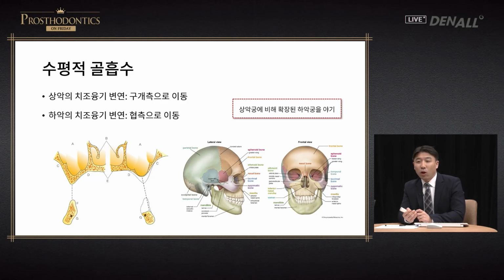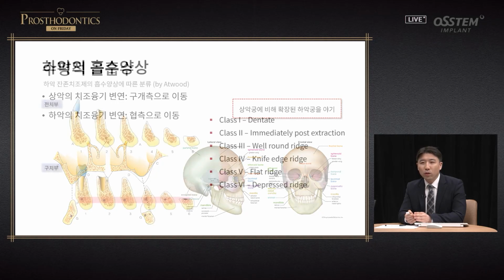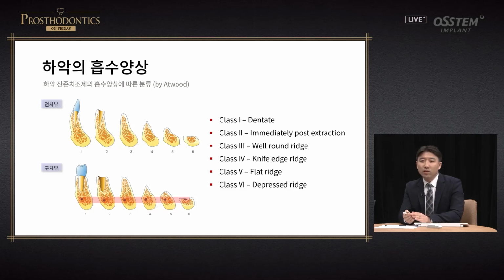If significant time has elapsed since extraction, when making denture and aligning artificial teeth, it can be difficult to choose what as basis. In the case of lower, there are major landmarks that we need to reference in doing teeth alignment. When you take impressions, such landmark needs to be registered. It's very important. Let's look at bone resorption pattern.